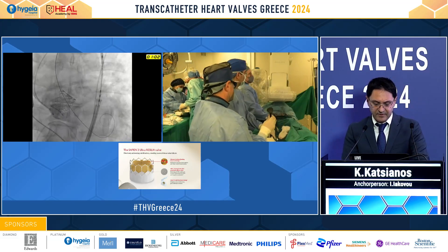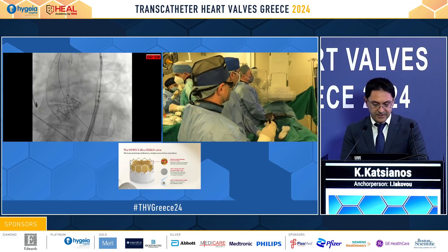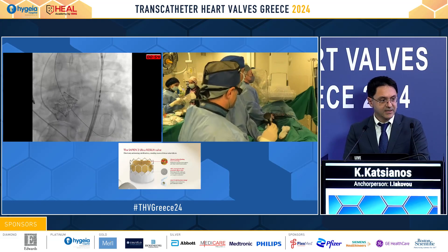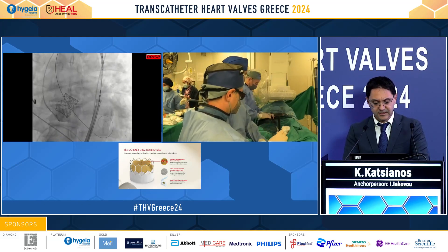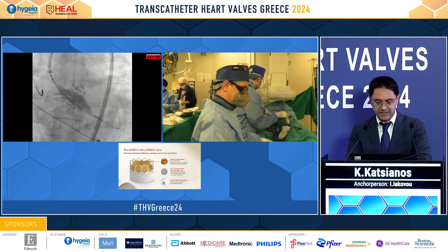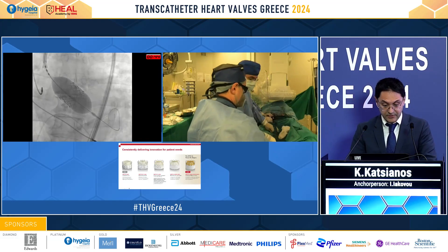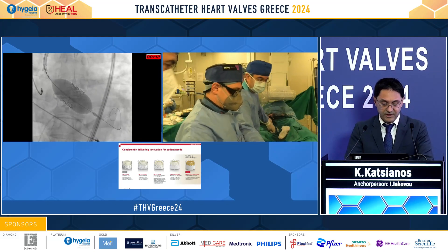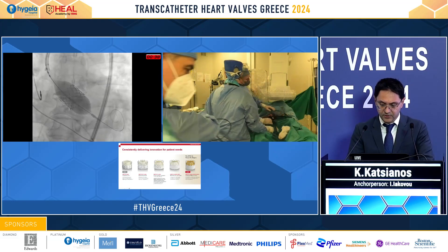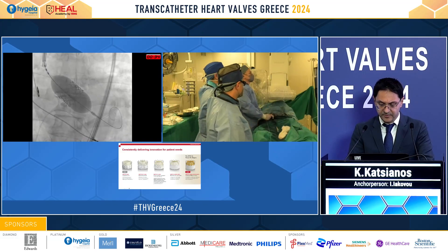We see that the valve was not optimally expanded. Since it was also a very large annulus, we wanted maximum expansion of the valve. So we decided to proceed with post-dilation, adding another 2ml — a total of plus 4 — during rapid pacing.